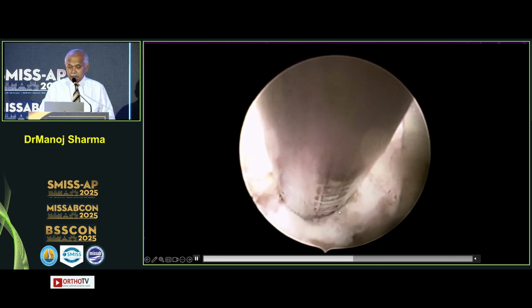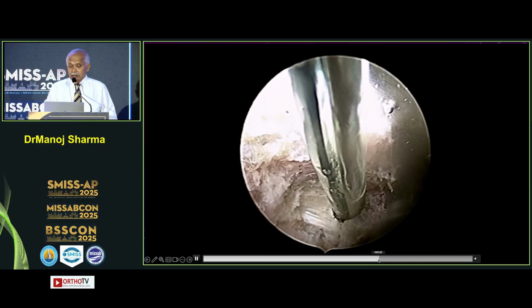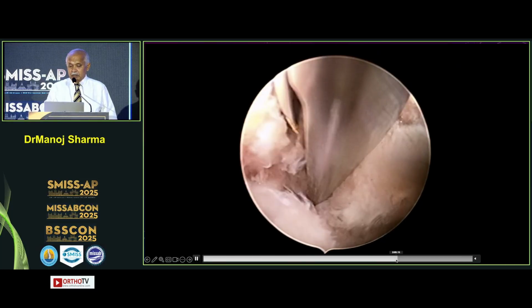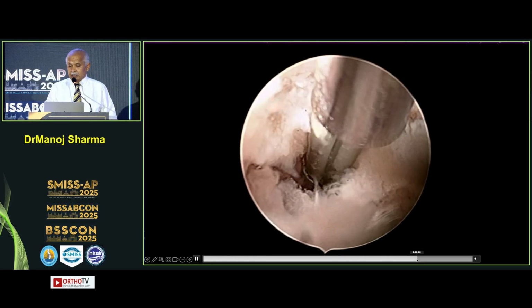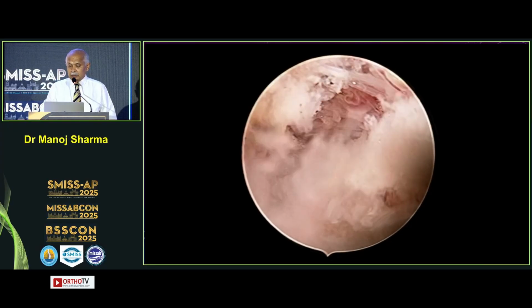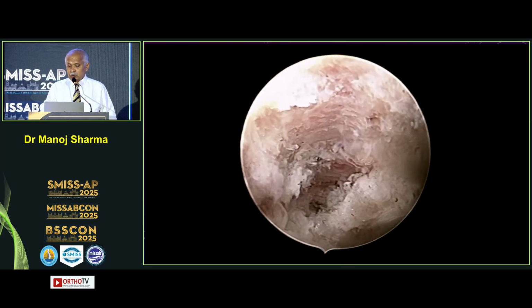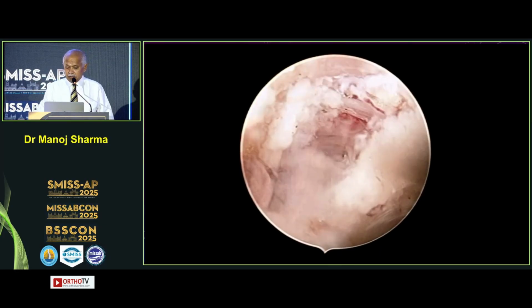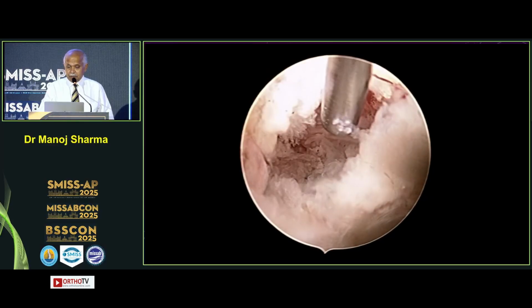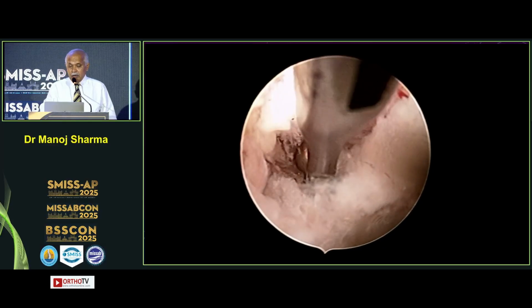And you see the burr, and you see the final piece has been taken out, and now you see that pulsating thecal sac. And this is a probe by which I'm checking that everything is free.